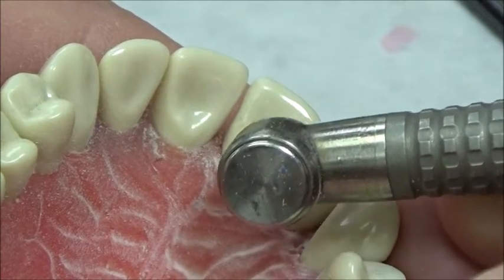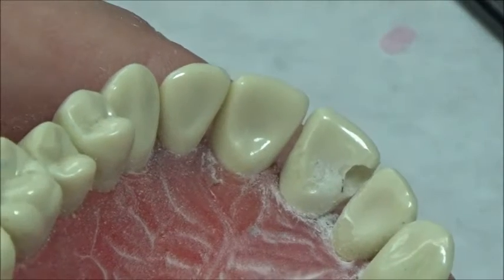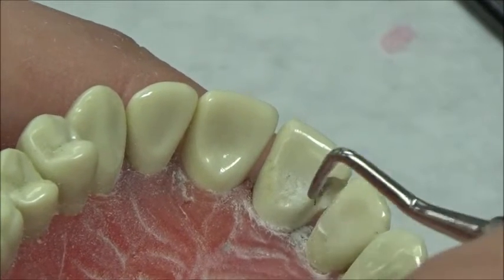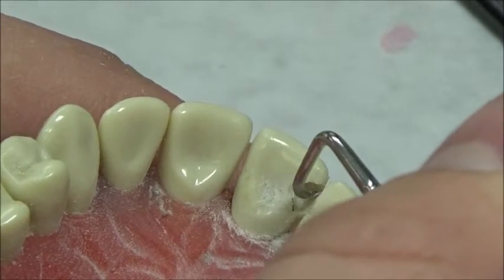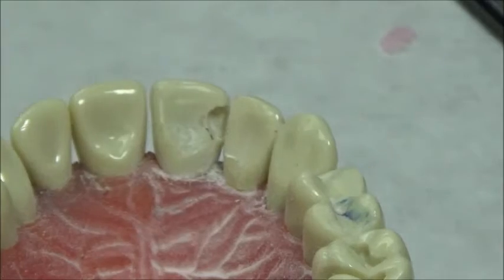I'll smooth things up a little bit. The important thing is to have a 90-degree exit angle here, and the gingival exit angle also needs to be as close to 90 degrees as possible. We're going to put a bevel on these surfaces because they're all going to be in enamel, and we'll also bevel the gingival exit angle.